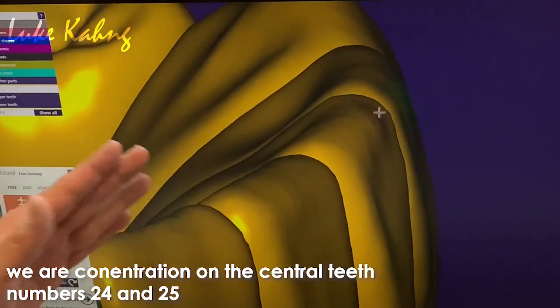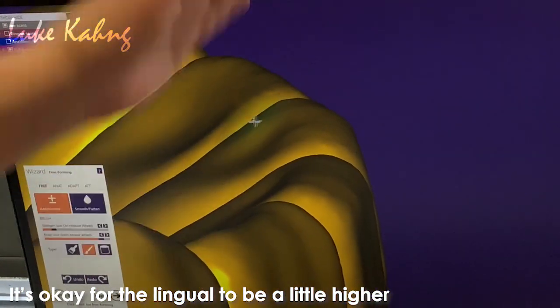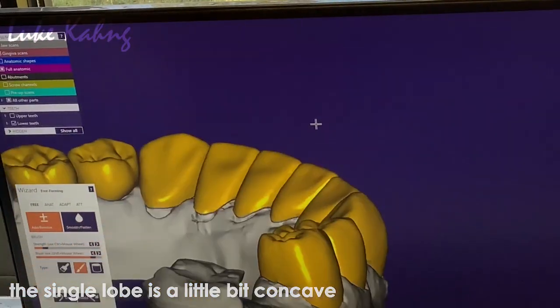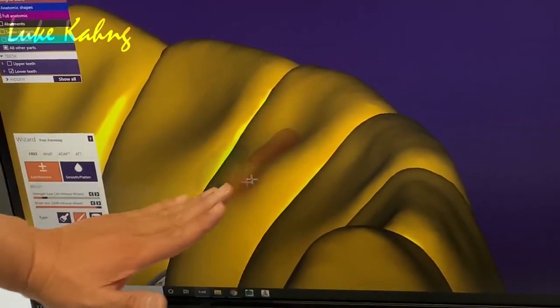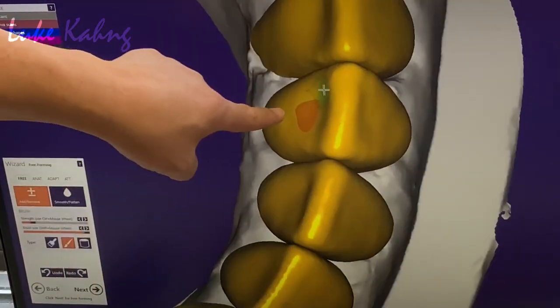Better, and the lingual is higher, that's okay, inside the edge. But the cingulum is a little bit concave. Here, yeah, a little concave. All the way here, more concave. No room, then stop. Okay, yeah, getting better.